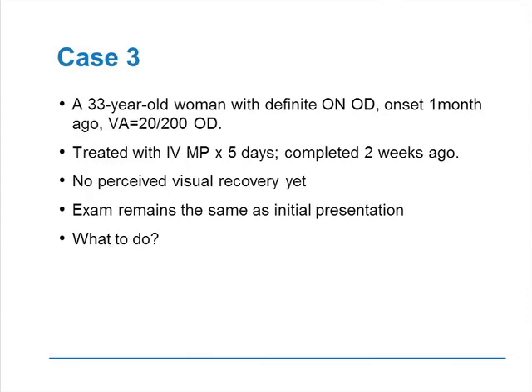Well, we acquired an OCT, and this is what her OCT looked like. You'll see that she does have retinal nerve fiber layer loss in the right eye, and that it's down to 52 micrometers in the right eye, compared to 86 micrometers of retinal nerve fiber layer in the left eye.